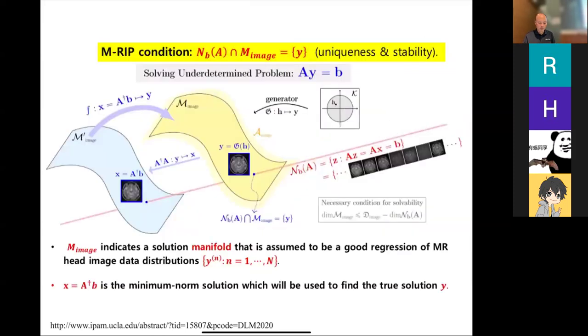And so what these deep learning networks are doing is they're saying, well, I basically want to just sort of find this weird shape thing, which neural networks are really good at, right? And I want to project, my solution needs to be part of that low dimensional manifold. And I'm looking for whatever is on that low dimensional manifold that also fits my data, and that's going to be my solution. All right.